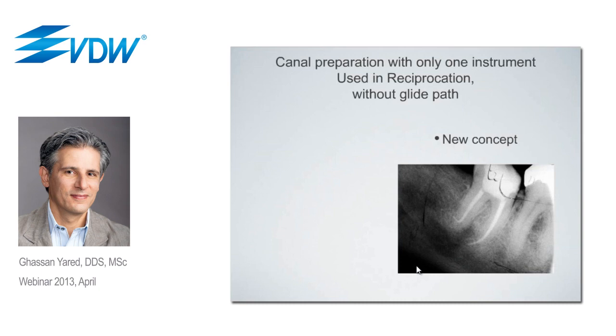And well, today I want to present to you this new concept using the canal preparation with only one instrument used in reciprocation without creating a glide path in most of the cases, and even without the need to use hand files before using the Reciproc instrument.